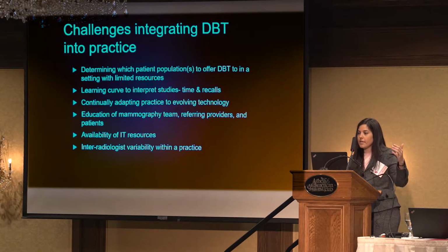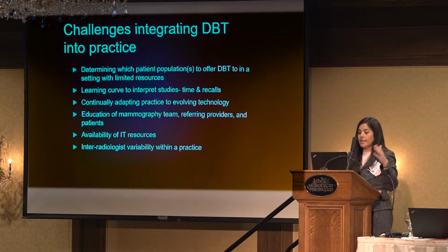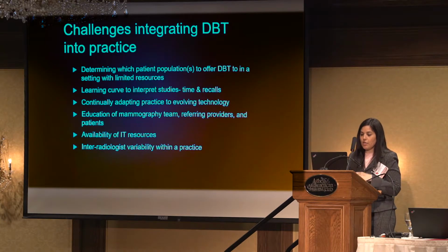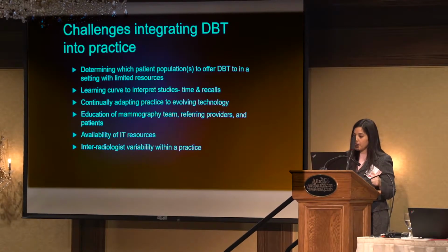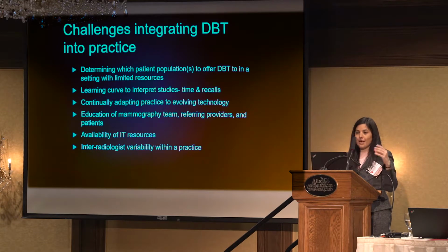You have to continually adapt your tomosynthesis practice. So since we had it, the FDA approval changed. So we've had to revisit our imaging protocols, consider radiation dose, make a decision as to whether or not we wanted to change our protocols, adapt continually, because this technology is continuing to adapt. We really have to work with our mammography team, our referring providers and patients. Actually, we've developed better relationships with our IT support. They've been up in mammography a lot more than they ever have in the years prior.